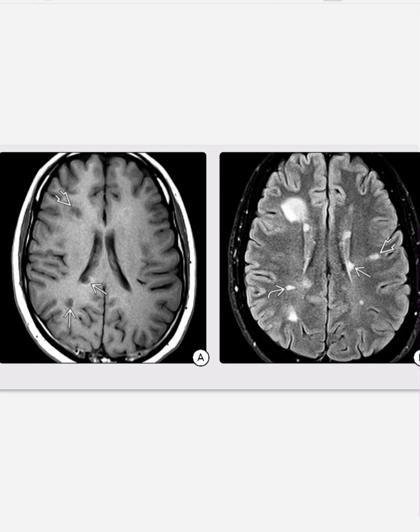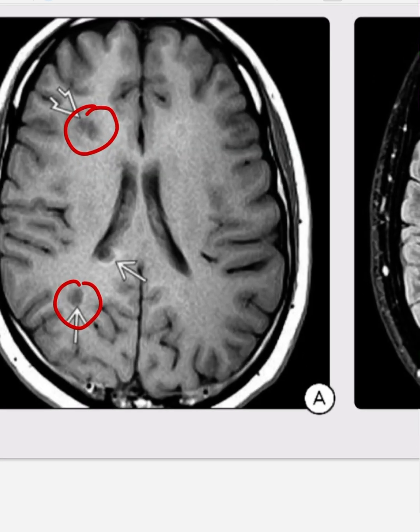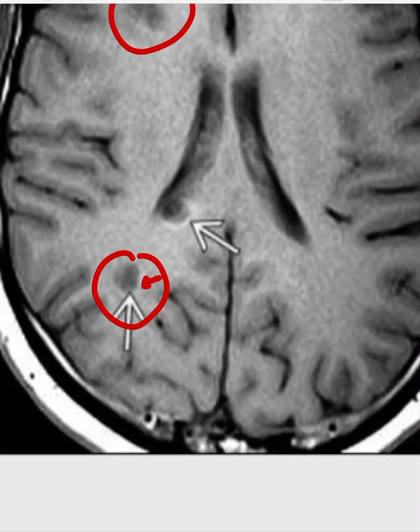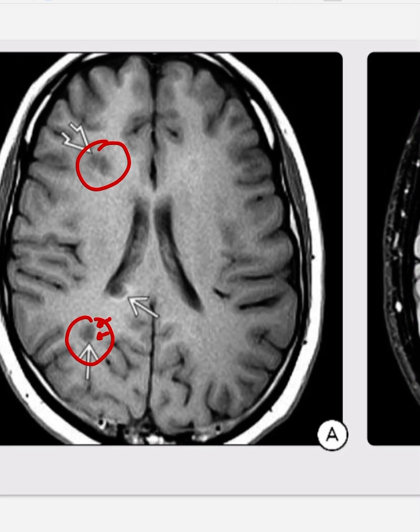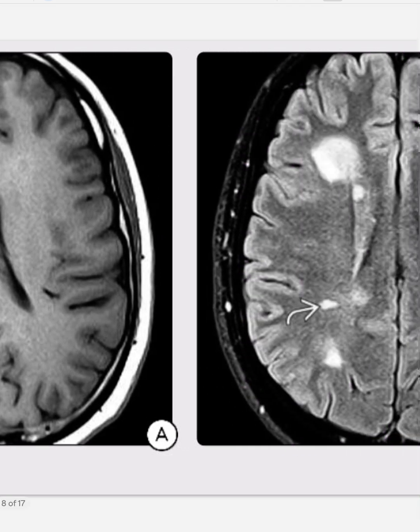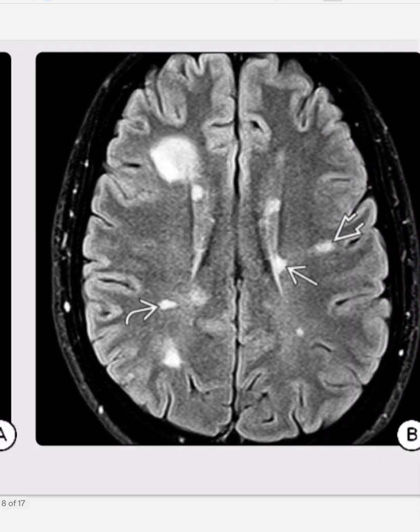The next case is a 32-year-old male with severe headache and visual disturbance. The axial T1-weighted image shows multiple hypointense lesions in the deep white matter with a faint rim of T1 shortening — a faint rim is seen around the hypointense areas on T1-weighted image.